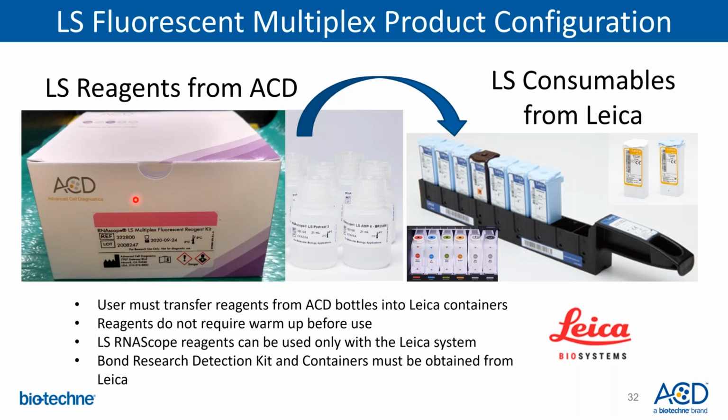You would have bottles in the kit that would have the respective reagents, which have to be filled into the containers or consumables that need to be purchased from Leica. So as I said, you must transfer reagents from ACD bottles into Leica containers. They do not require warm-up before use, and they can only be used with the Leica system. The other thing also to keep a note of is that the Bond research detection kit and the containers must be purchased or obtained from Leica Biosystems.